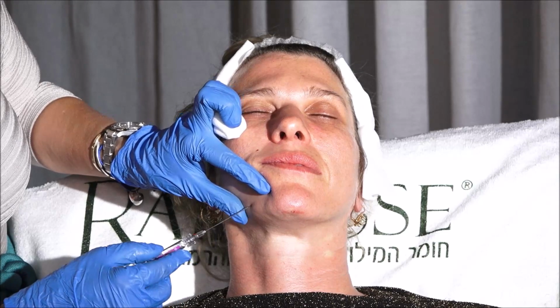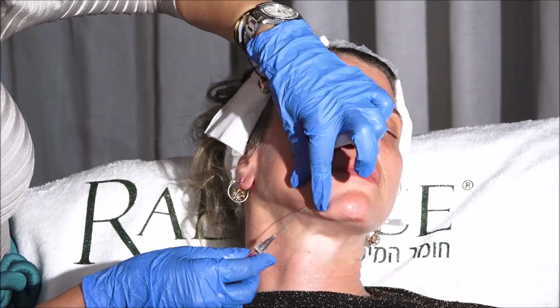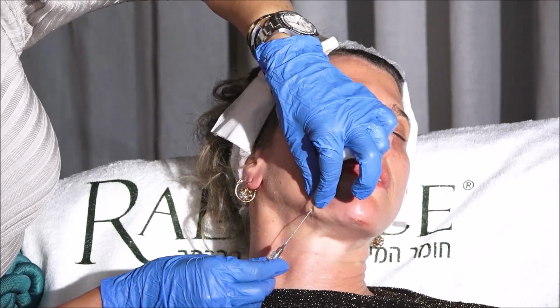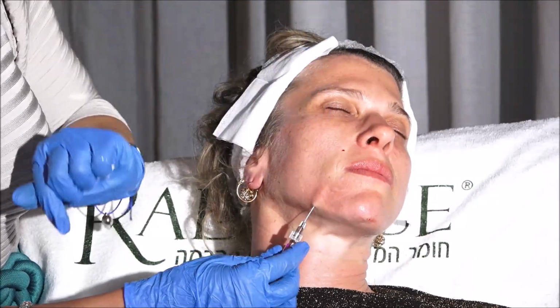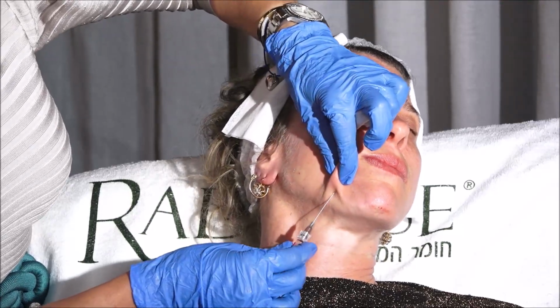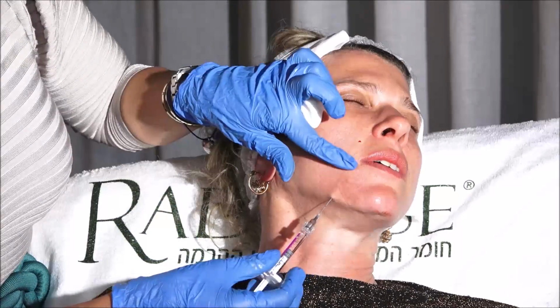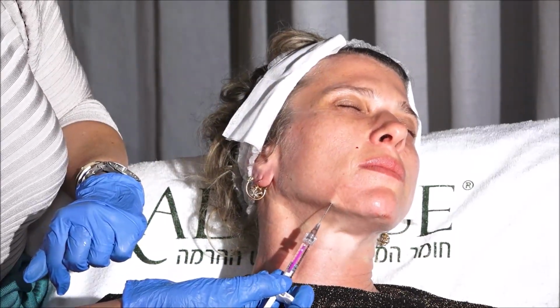And then with the rest, I can do down here. So my injection of Belotero Volume here is deep. I want to go deep to the modiolus here. If it's superficial, it doesn't work. You see the tip of my cannula is deep.